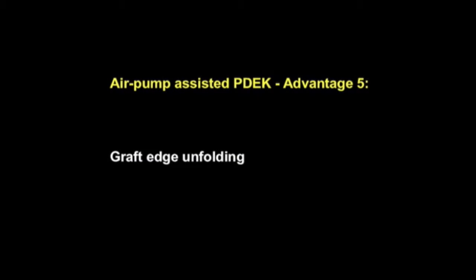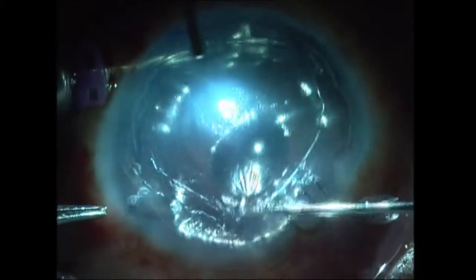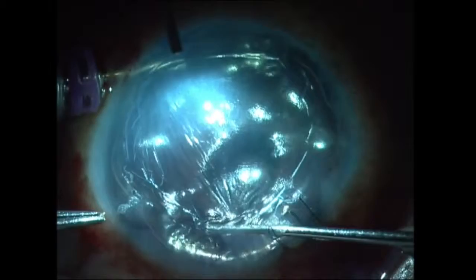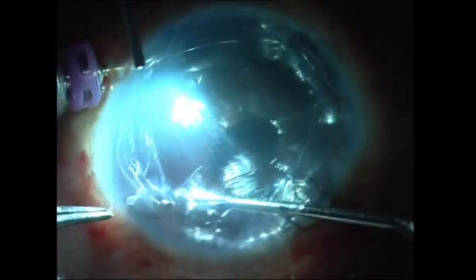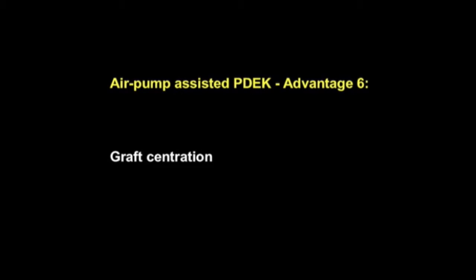If you look carefully, you can see that small little bit of a fold, which will come now in the video again. There's a small little bit of fold on the left hand side, and I'm unrolling that by going into a plane between the Descemet's or the Dua's layer and the stroma. And the advantage is the air is holding it up like a third hand within the anterior chamber. It's preventing it from falling down.